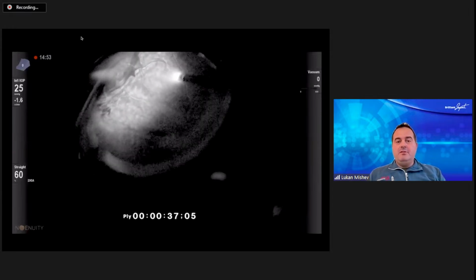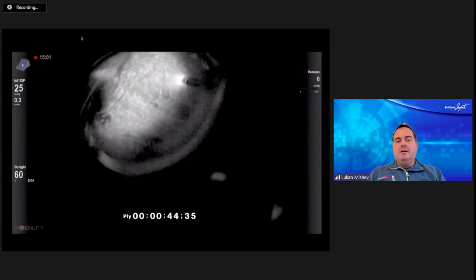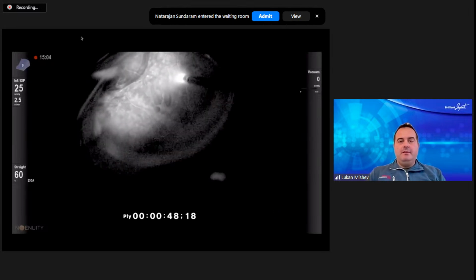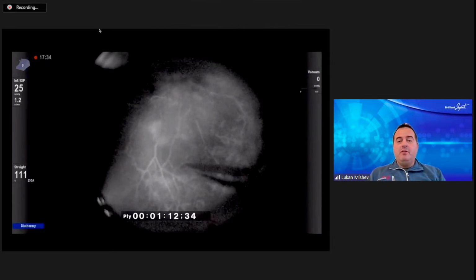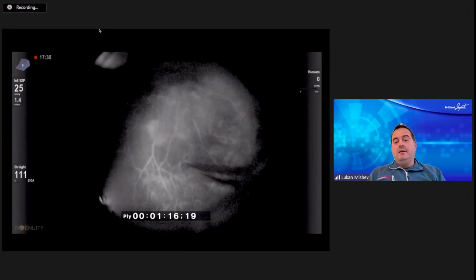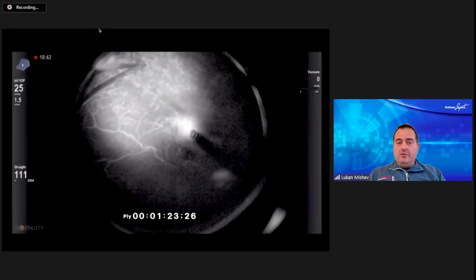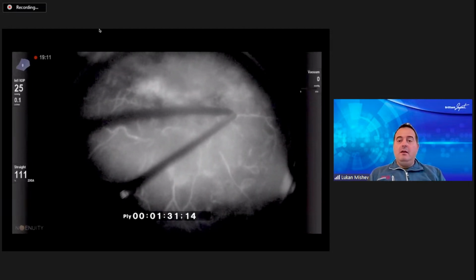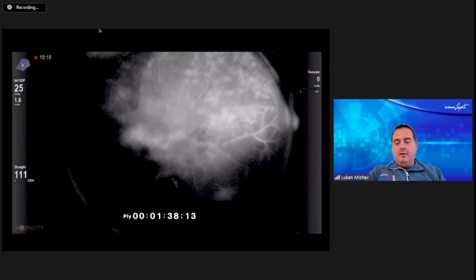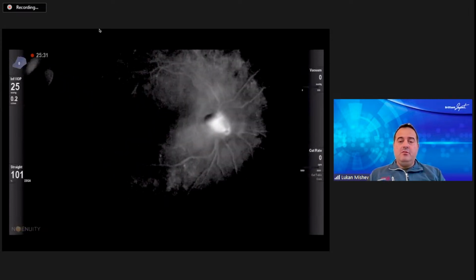Here, this is a blood collection, something related to the question of Hudson. It is not new blood, because if it was new blood, it would be fluorescent stained. So here, this is a navigated endodiathermy, so we can see from where we might have a postoperative bleeding. This is related to the study that Alan is performing now. So it is another useful thing. We can treat selectively where we have leakage, and it will probably lead to less postoperative bleeding in such diabetic eyes.